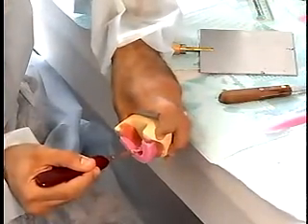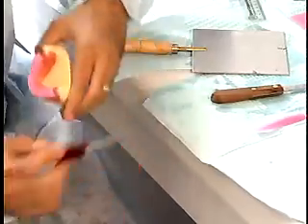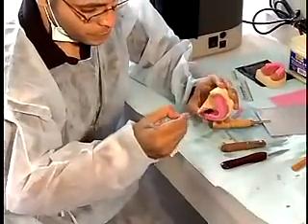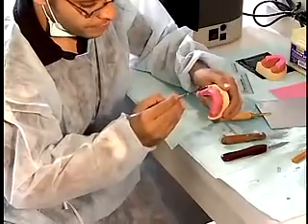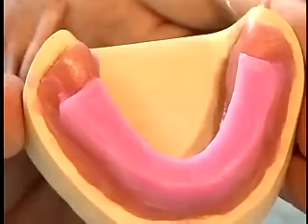Posteriorly, the wax rim parallels the base of the cast, the residual ridge, on a plane intersecting the retromolar pad at 2/3 of the pad's height. Note that the rim's occlusal surface ends at the distal of the first molar and is beveled posteriorly and inferiorly.